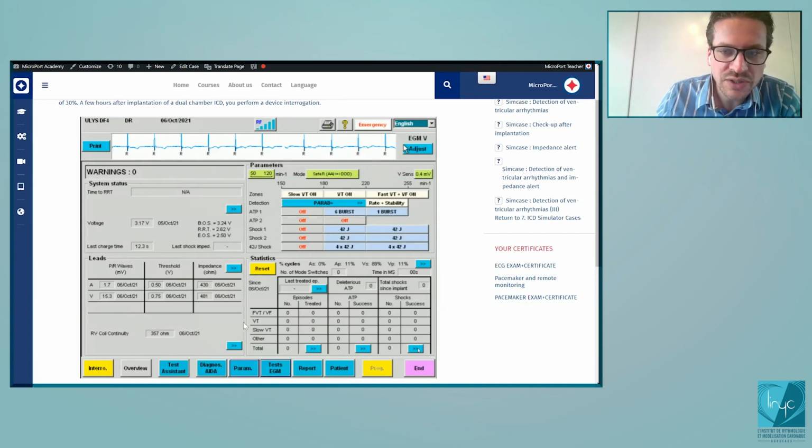So this is a lot of information, but the funny thing is, now you had a lot of time to look at this screen. So far, I think most of you won't have seen anything of interest out of the case. Is there anything peculiar? If you've seen anything strange, please put it in the chat or open your mic, because when I saw this screen after implantation, I was quite worried. I was not happy at all, and it had nothing to do with programming or the numbers we're seeing, but more with the tracing we see on top.